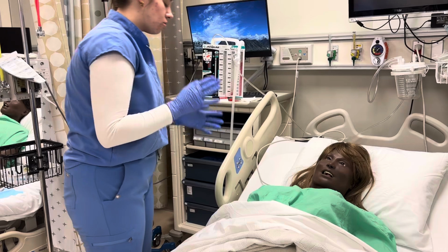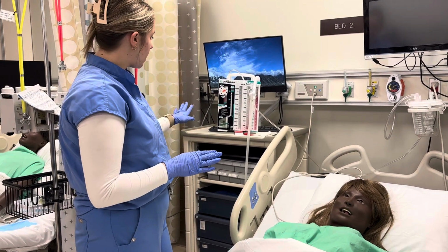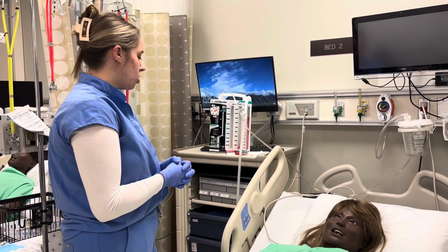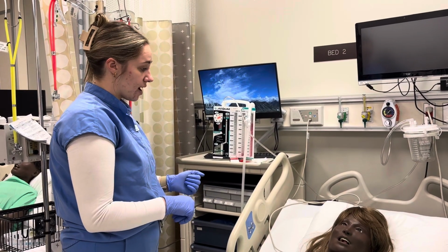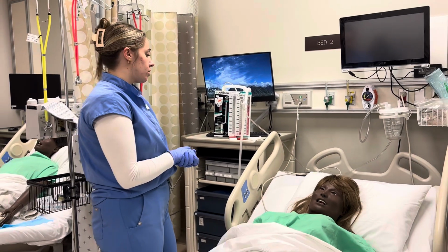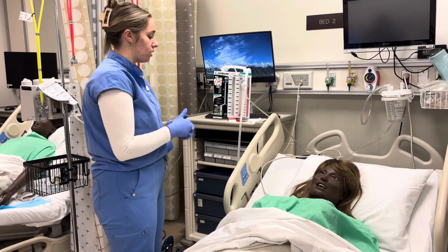Some things that we just want you to watch out for are excessive bubbling or not bubbling in that chamber. If you hear any sounds, if you're having any pain, those are things that you would notify us with the call light. We just want to make sure that we stay on top of it, that there's not any risk of infection or problems with draining that fluid from your lungs.